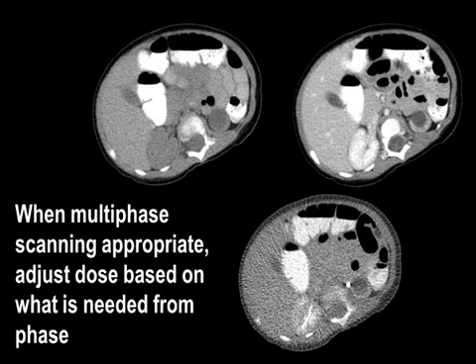Now let me move on to one of those other major modifications that we do, which is to avoid multi-phase examination. So when you do a pre-contrast or post-contrast study, or you get delayed images, then it's an additional phase. And unless you change the settings, the dose is going to be a multiple of how many phases you do. And oftentimes it's necessary, but not always. And it tends to be done more in adult imaging than it does and should be in children.